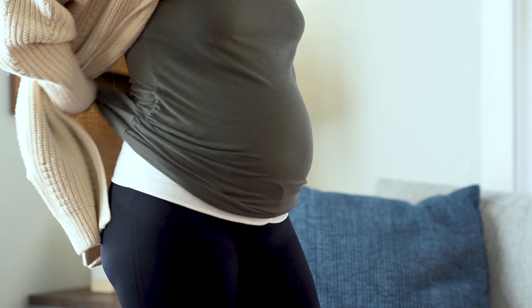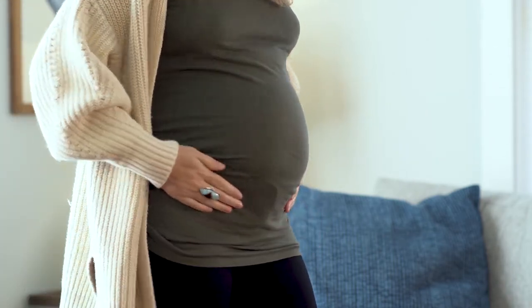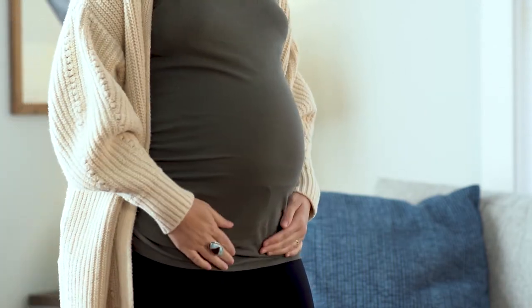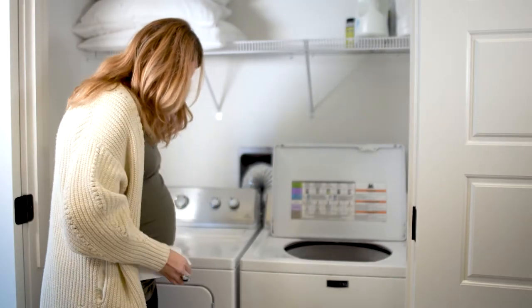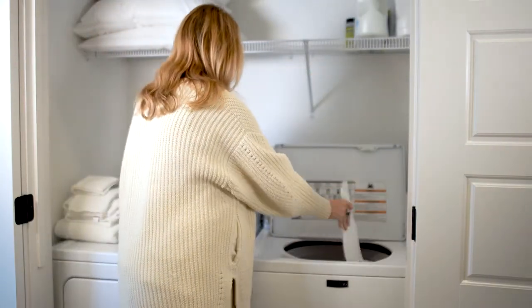Motif's band is discreet and made to seamlessly blend under clothing or comfortably over clothing. And with a soft, breathable fabric, the Pregnancy Support Band is easy to clean — just simply throw it in the wash between wears.